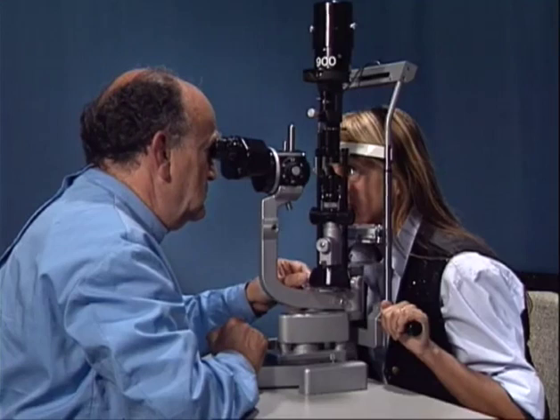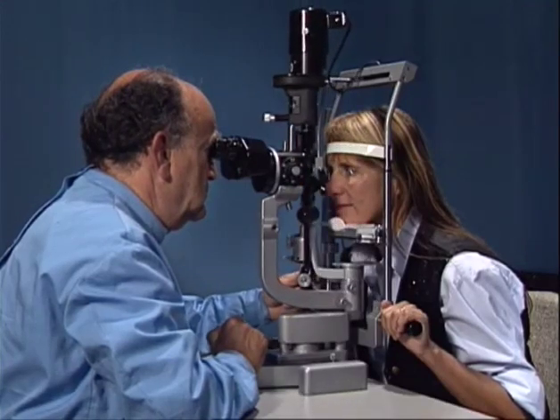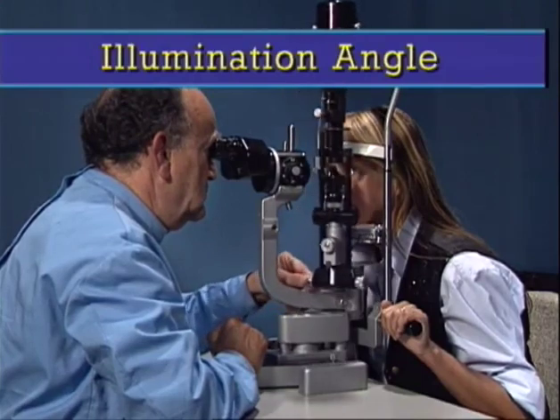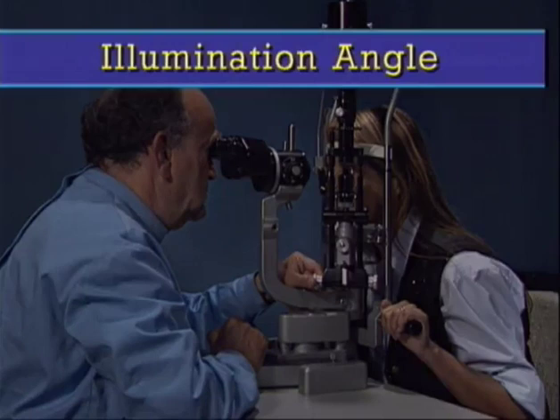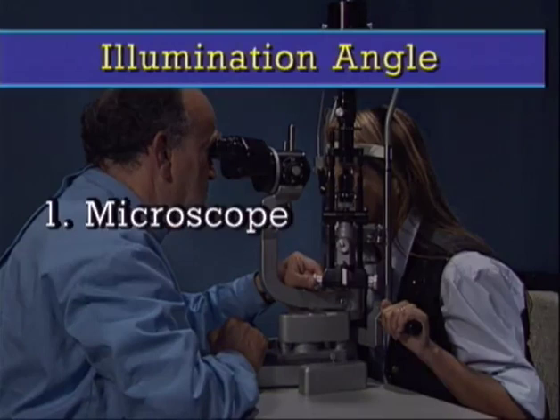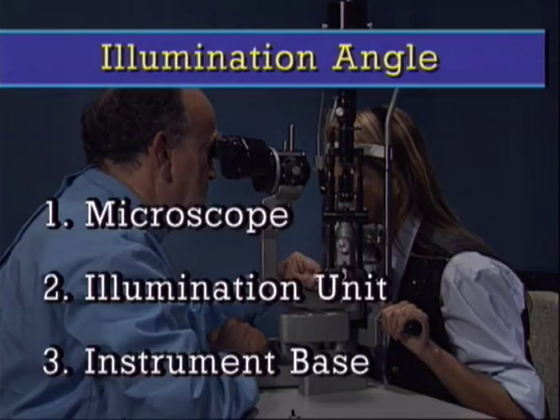Then how can we find the specular reflex in a given clinical situation? The proper illumination angle is found empirically by considering three factors: the microscope, the illumination unit, the instrument base with the microscope and the illumination unit. Depending on which of these three factors is varied, three basic techniques of examination can be distinguished.